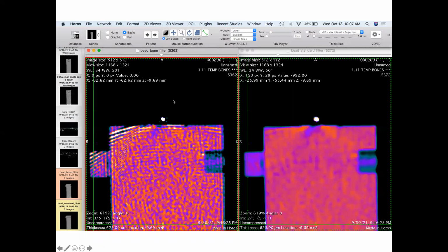And here's an actual example from CT data where you apply the Ram-Lak filter, or something very close to it, on the scanner. They usually never put in a pure rectangle because it looks ridiculous. It still has those high frequencies, and you can see a lot of edge ringing here. And then this is with something close to a Hanning filter, so it smooths out a lot of the noise and a lot of these artifacts off sharp edges.